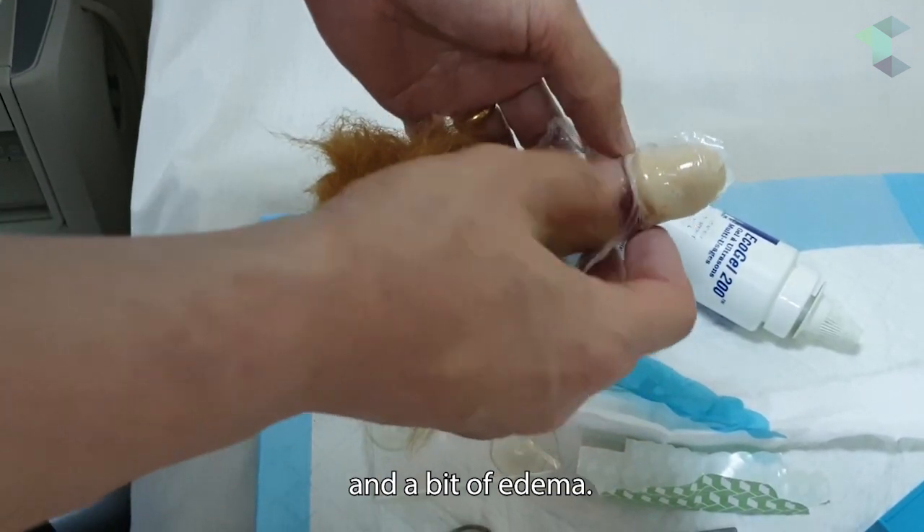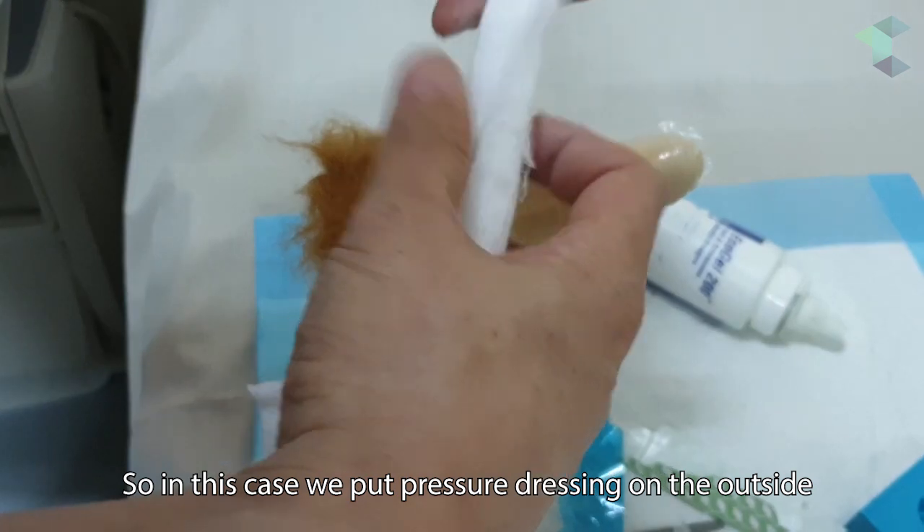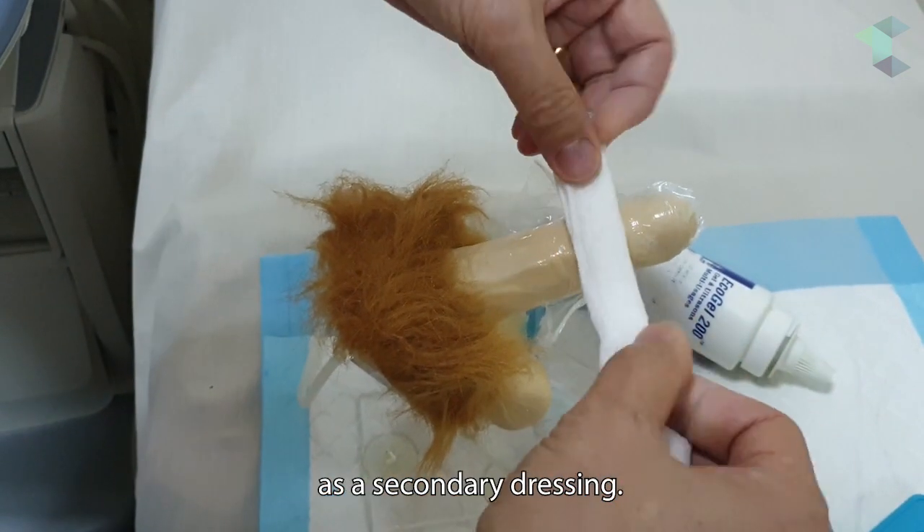There might still be a bit of bleeding on the wound and a bit of edema, so in this case we put a pressure dressing on the outside as a secondary dressing.